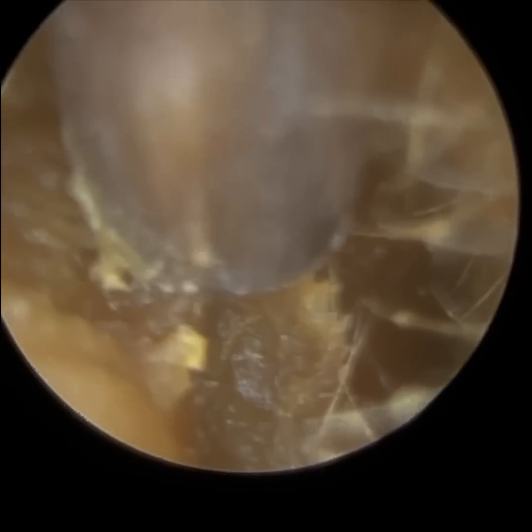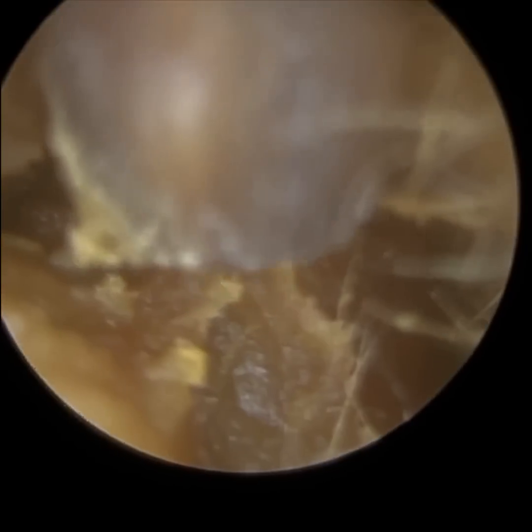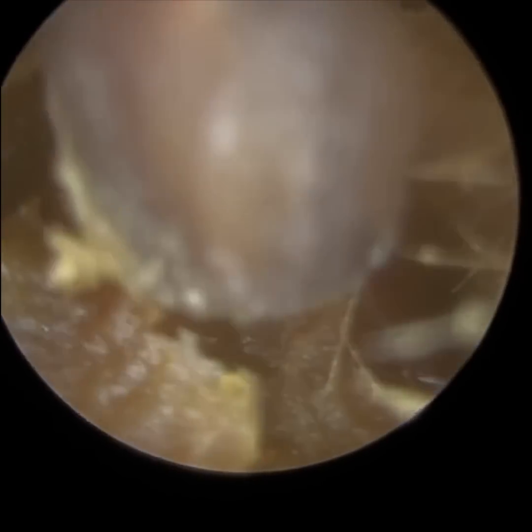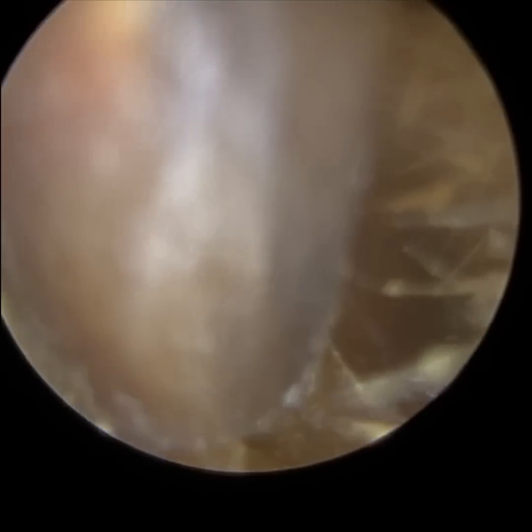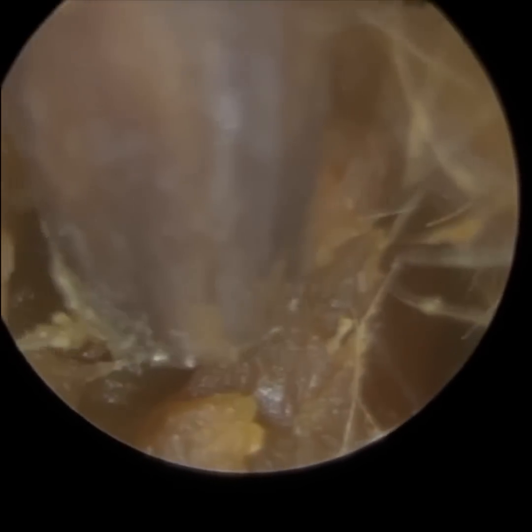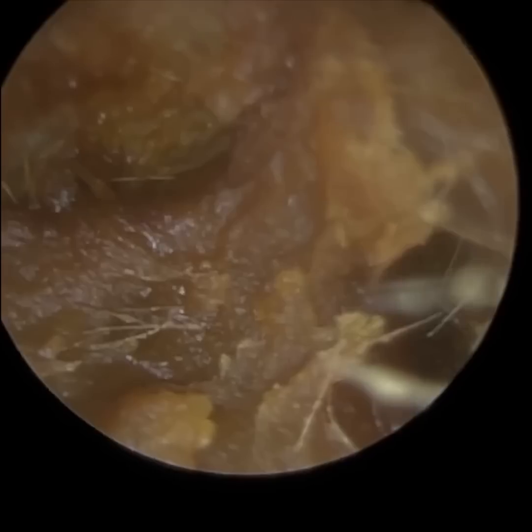And I also say it's the consistency of this. It's quite sticky and mushy, so as it's migrating out of the ear, it's just attaching itself and adhering itself to the canal wall. Now, the wax plug extends right from the entrance to their eardrum.